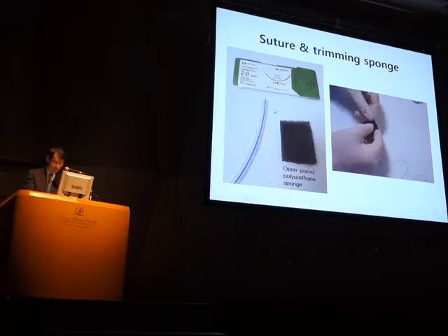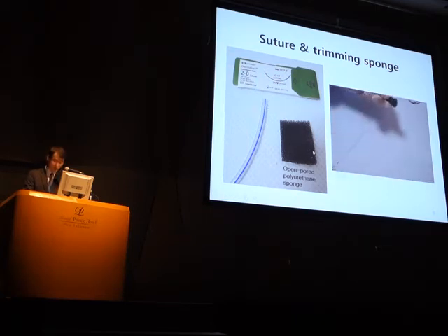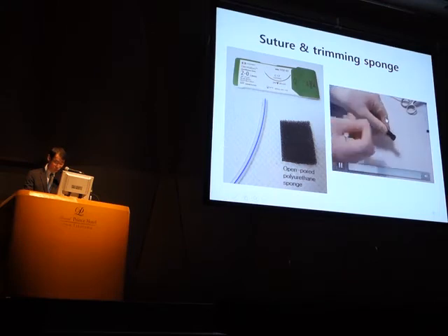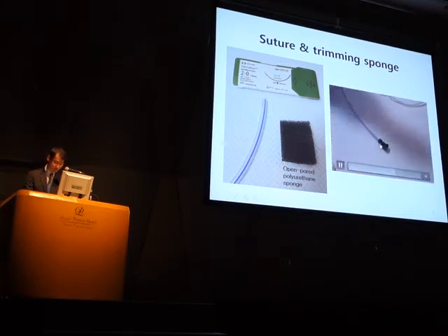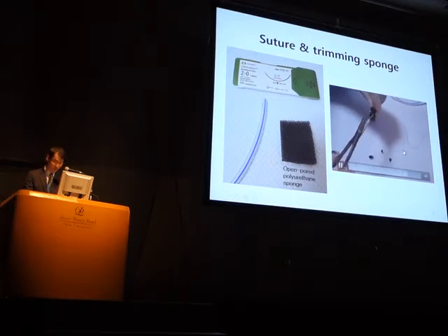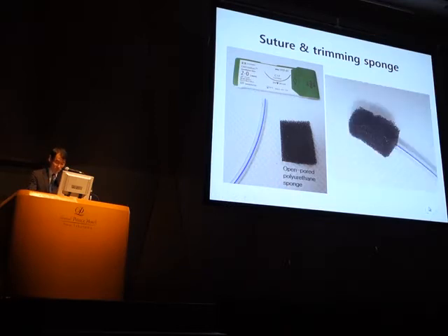After cutting the distal part of the tube, leaving 1 or 2 holes, a polyurethane sponge is sutured to the tip of the tube. Trimming of the sponge is required according to the size of the cavity. The sponge size needs to be smaller than the wound cavity to promote collapse.